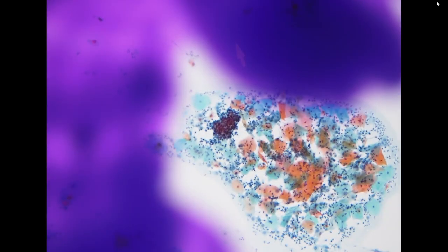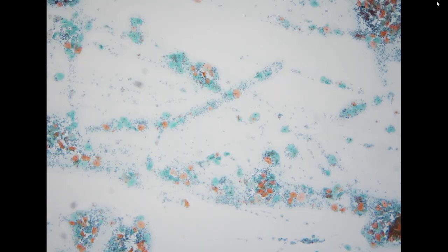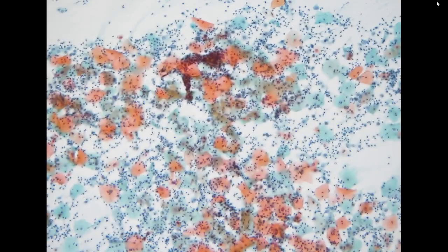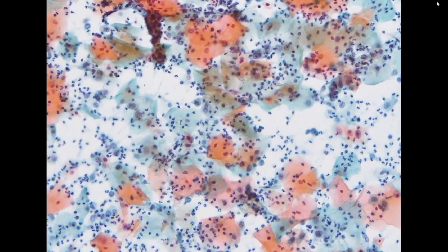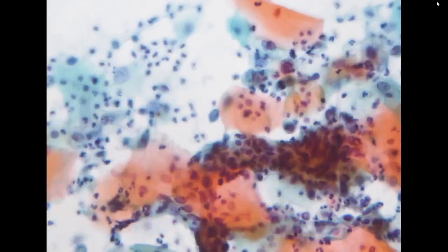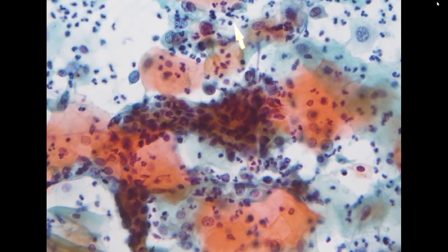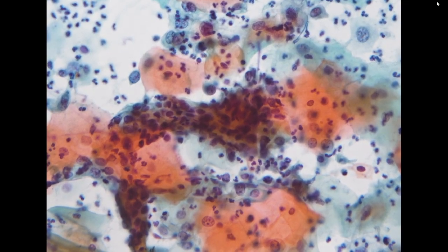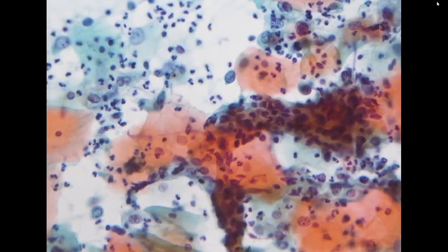So our main differential diagnosis would be HSIL. Originally the screener called this specimen squamous cell carcinoma. I think this is a bit over because we didn't see any necrotic debris, tumor diathesis in the background. We only see these very tight clusters of squamous cells with hyperchromasia and high NC ratio.